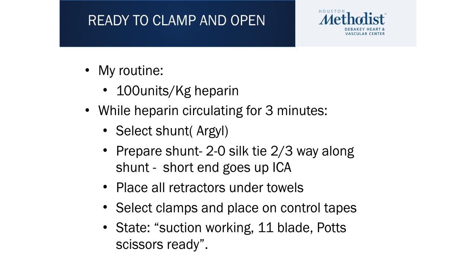I then cover all the retractors with towels. The only things on top of the towel are the tapes around the target vessels, and I take my clamps and put them on those tapes. I put the angle DeBakey on the tape of the common carotid artery, and I put small Profunda clamps on the external and internal carotid tapes. Nothing is clamped at this point. I then check that I've got everything I need before opening the carotid artery — suction working, 11 blade, Potts scissors ready and working, and the patch open and prepared.